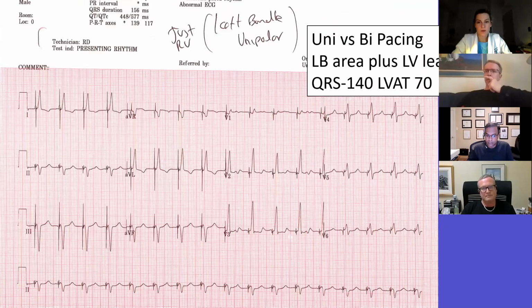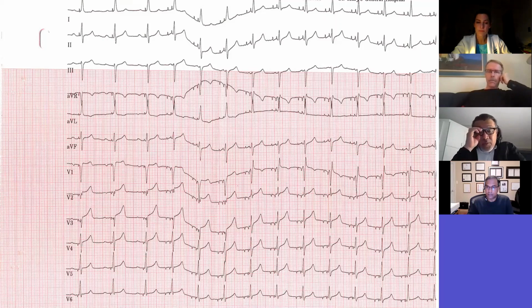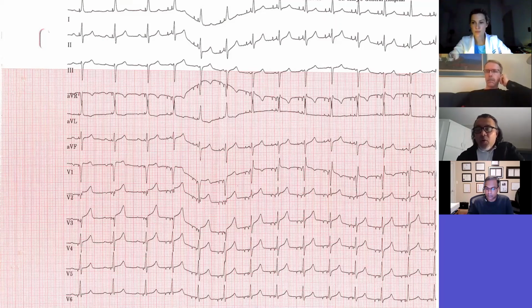Yeah. Okay. I have a comment just to be previous. Yes. So two things. First, if the acute threshold is lower than 2, as Atul says, always at the end of the procedure the threshold is going to be lower than 1. So I'm not taking any other measure to lower the threshold lower than 2.5 or 2, because it's going to be always better.